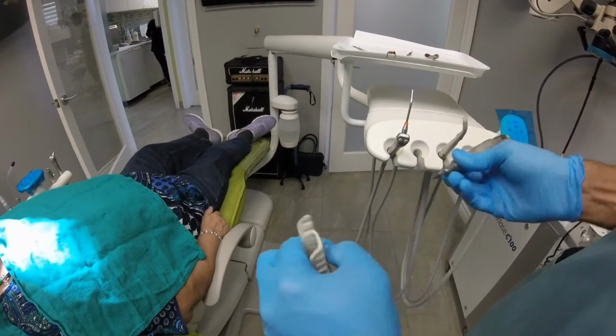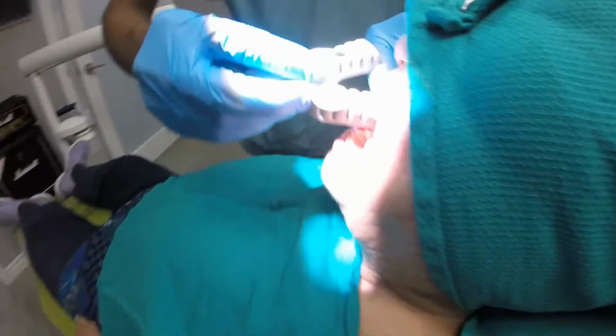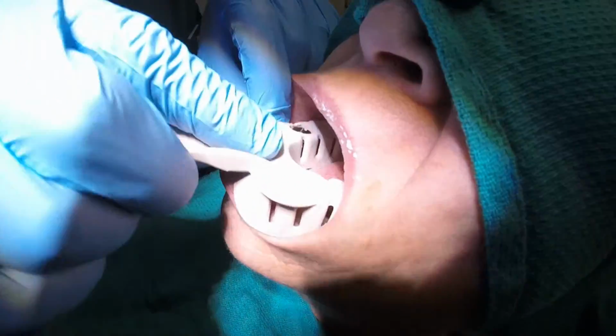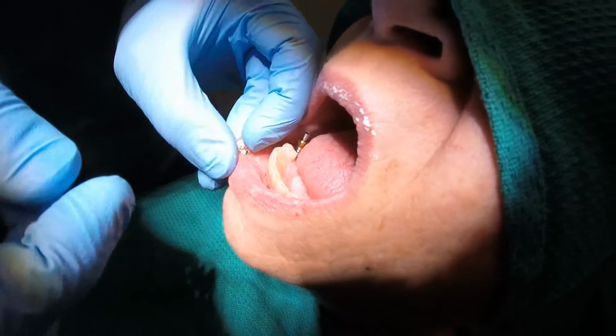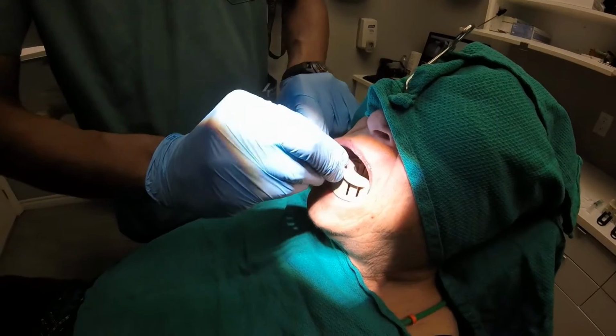Take some of the shrapnel off there, and you'll see here I'll put this impression tray in the patient's mouth, and didn't get all the shrapnel off. There we go, got it off now. We'll try this tray in. You can see that the screw port, we can actually access it.